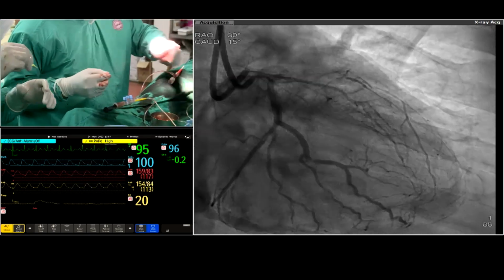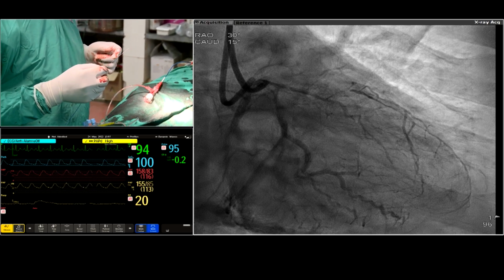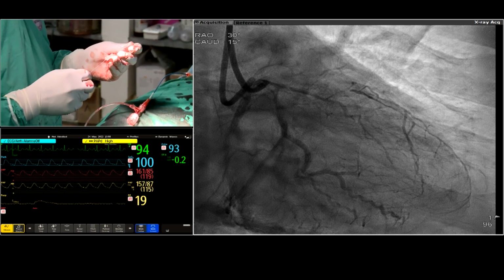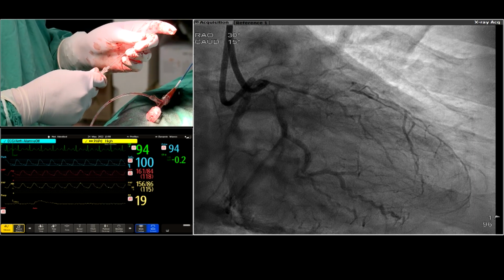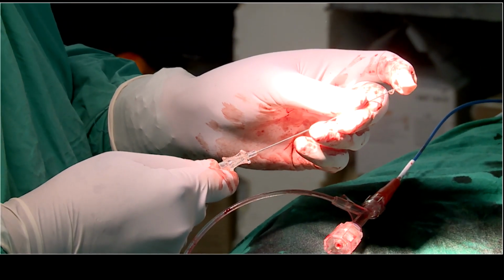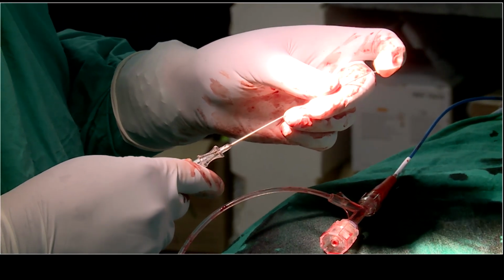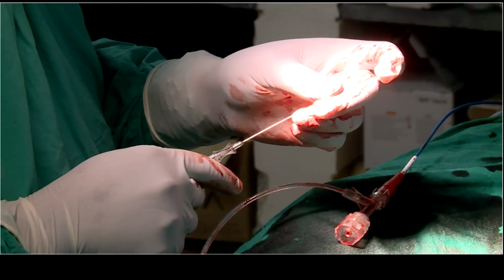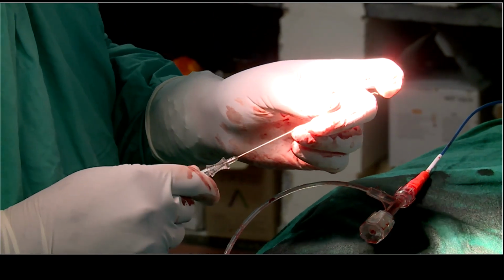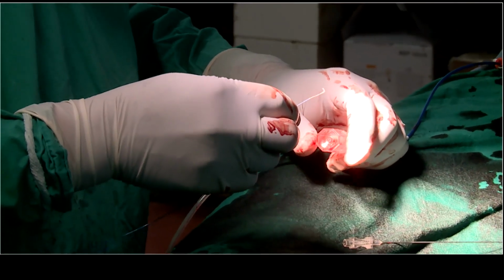हाँ, wire introducer वो होता है ना, you can shape the wire. Push the wire. छोड़ो. ये कौन सी वायर है ये? What wire is this? हाँ? Local floppy wire. Back. Wire back. Back, back.